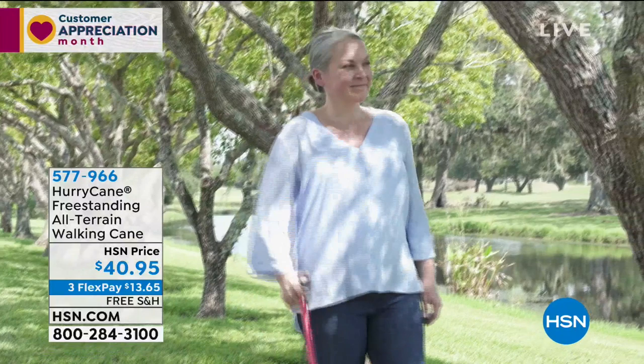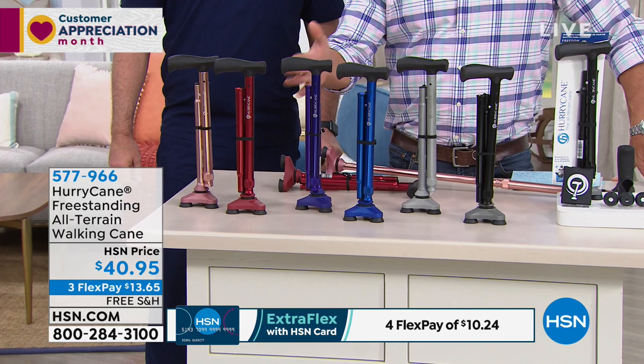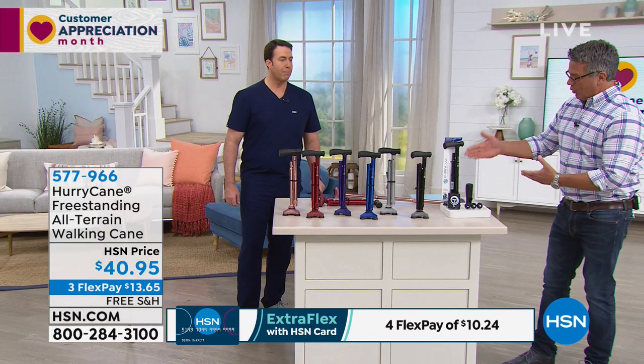If you'd like to get one of these, we have a variety of great colors today. I've got it in rose gold, red, purple, blue, steely gray, and black. And we're adding some bonuses to this as well. The whole thing folds up — it's one of the coolest things about this cane, and we'll show you how that works in just a bit.